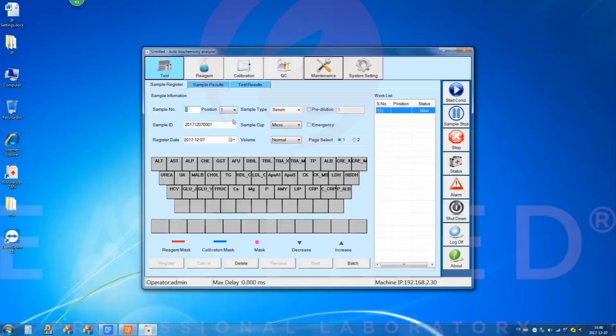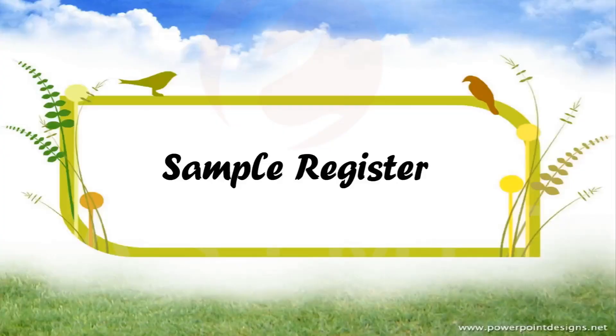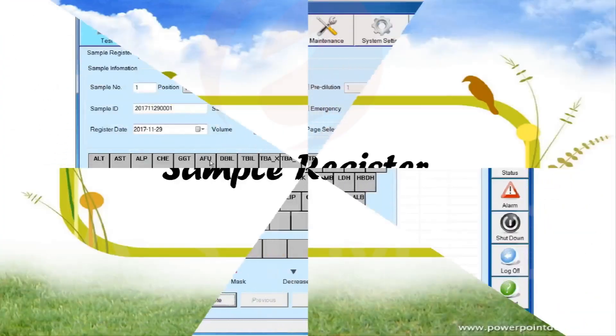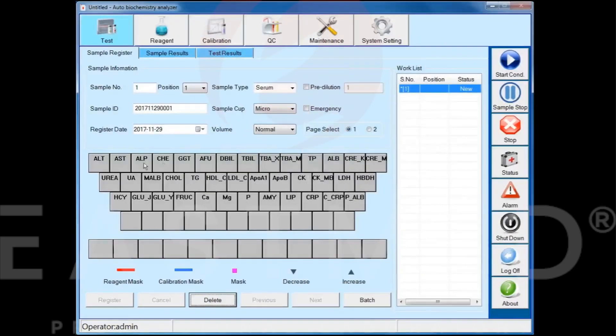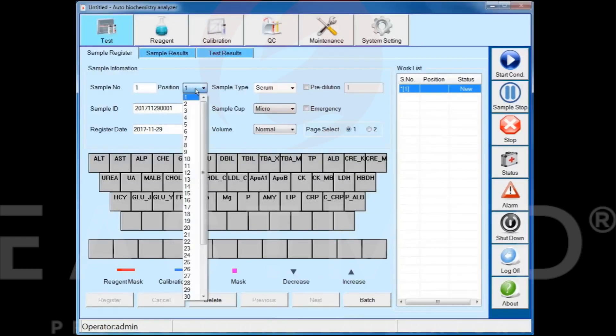Second part: sample registration. Enter the sample registration interface and preset the sample position.